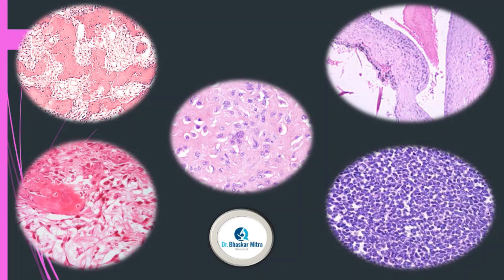may be the telangiectatic or vascular lesions. Some tumors itself have high vascularity, giving an appearance of a telangiectatic lesion. Some are true telangiectatic lesions. So in bone diagnosis, we see ABC-like areas in many of the tumors, and ABC itself is a pathological lesion.